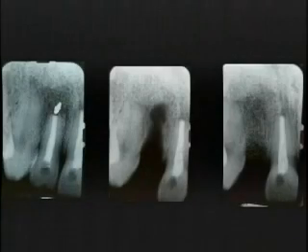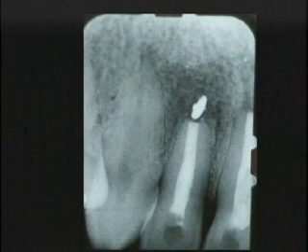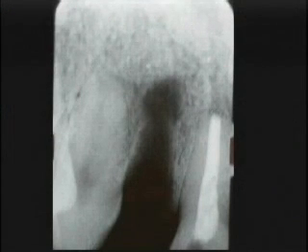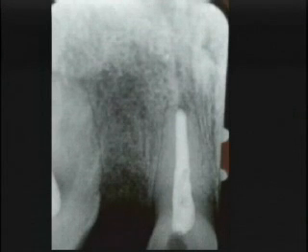This is an example of an extraction and bone graft. Simply enough, taking out the tooth leaves this gigantic defect in the bone. That could leave not enough bone available for dental implant placement, and also an uncosmetic soft tissue result. By being able to place a bone graft into the socket at the time of extraction, we are going to be able to maintain the soft tissue as well as ensure that there will be enough bone present for dental implant placement down the road.